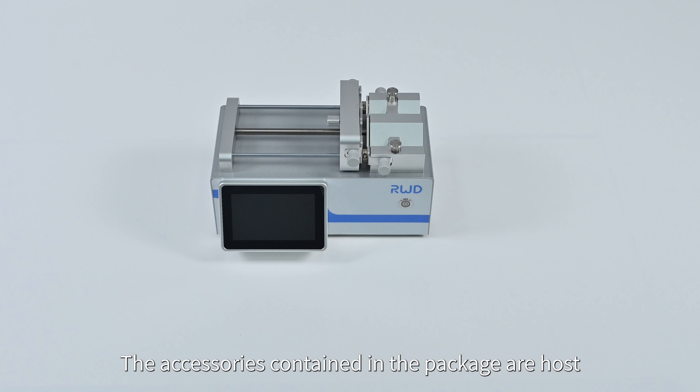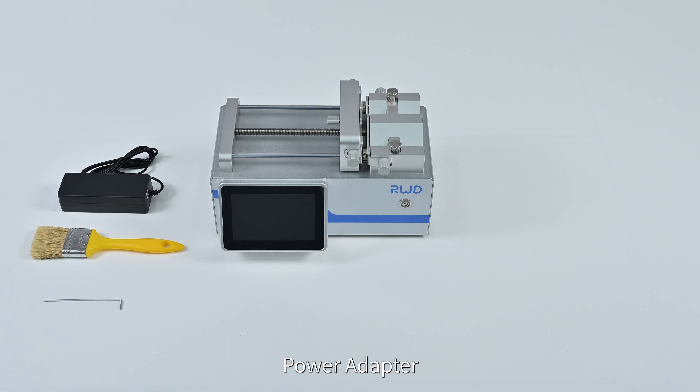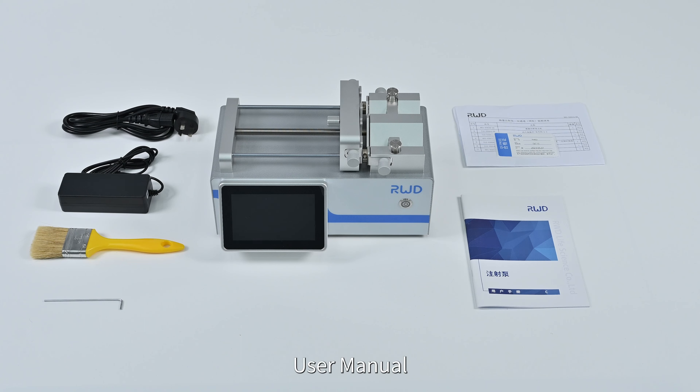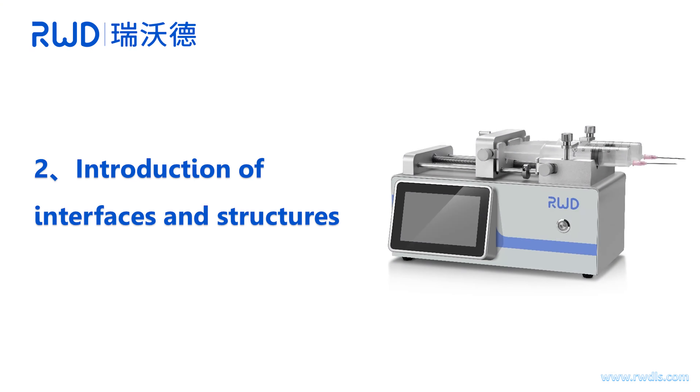The accessories contained in the package are: host, Allen key, cleaning brush, power adapter, power cable, packing list, certificate of conformity, user manual, and micro syringe (optional).